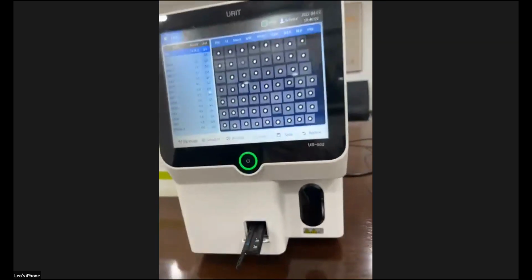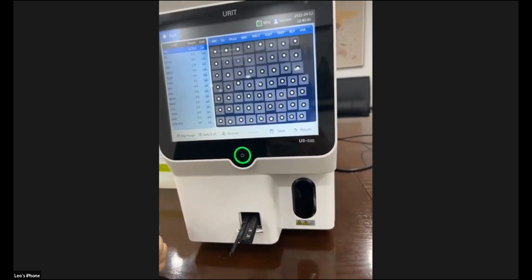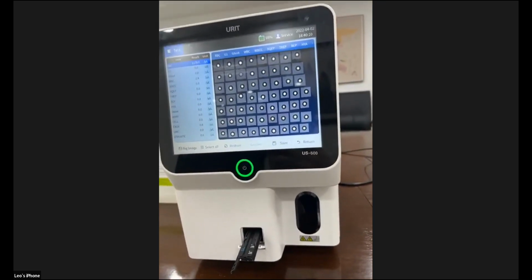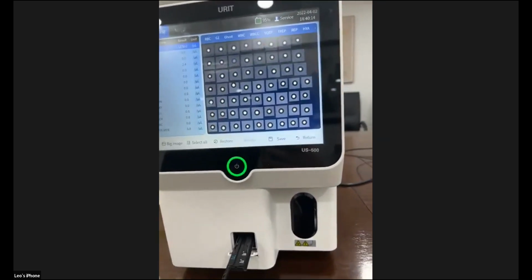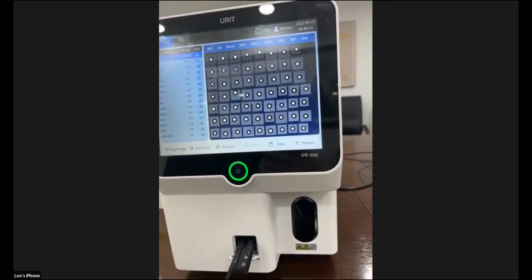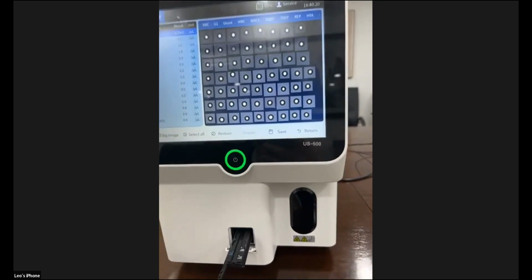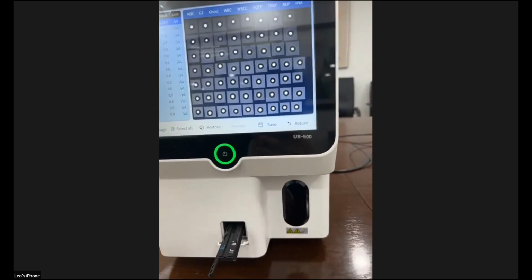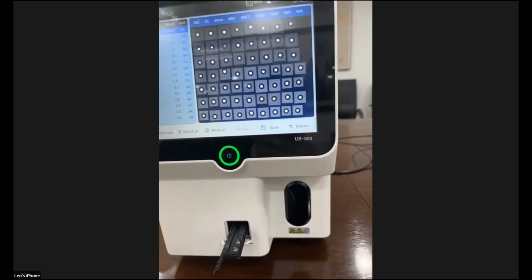I get your point. Actually, our machine is set to only select the cells when we test. So you can see that maybe there is some paper dust or dirt on the strips, and when we drip it into the tube, it will give some pollution to the samples.